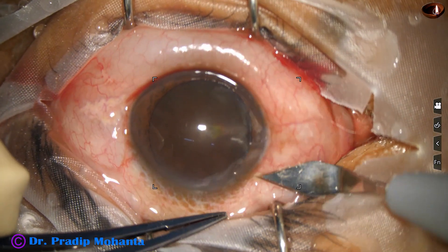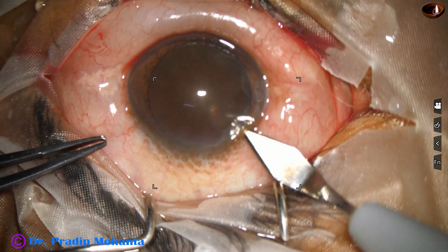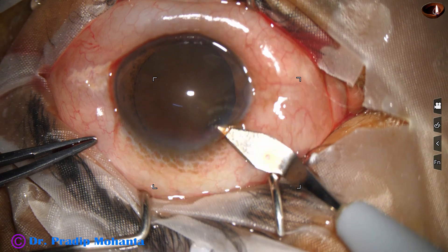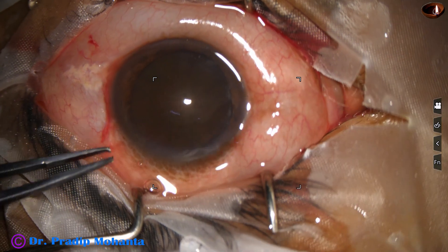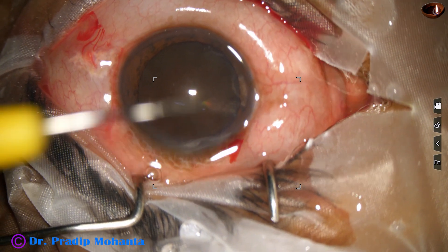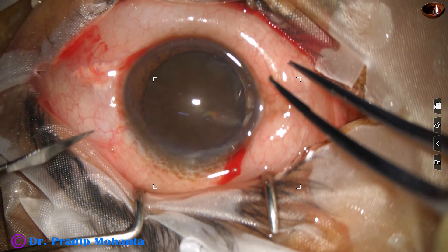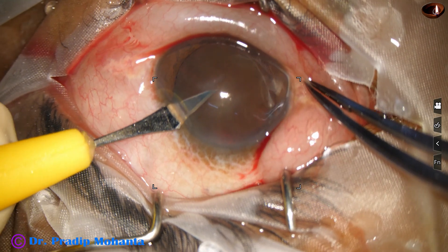I am going to make the incisions. This is the main incision at around 11 o'clock with a 2.8 millimeter steel keratome. The main incision is made. Now a side port is made at around 2 o'clock, about 3 clock-hours away from the main incision.